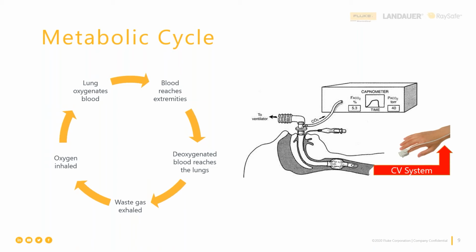One of the terms here that we'll jump into is perfusion. And Jerry, if you want to add a little bit of color there, that'd be helpful. So perfusion really talks about blood flow and blood volume, because with each contraction of the heart, there is a volume of blood, or a cardiac output, that is moving out to the periphery, to the blood vessels and arteries and to the cells.